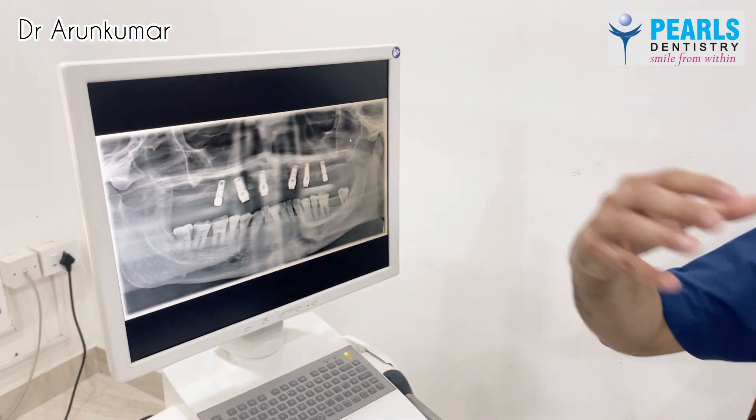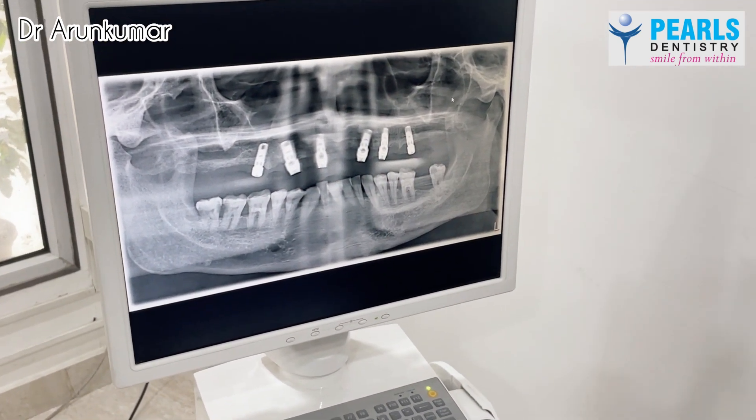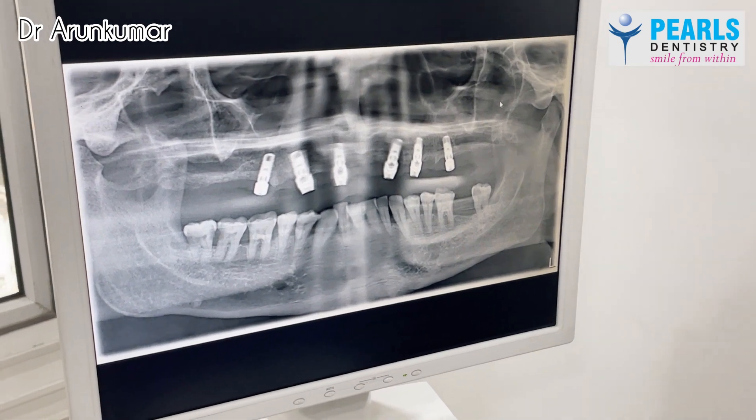Because it's a full arch case, we have already planned where the patient's final teeth are going to be. For the patient's planned final tooth position, we have determined where the implants will be placed and then designed the surgical guide based on that. So the implants are placed based on the actual plan we have done to achieve the final teeth position.